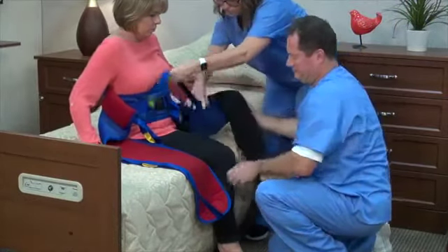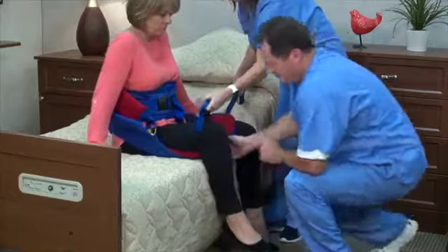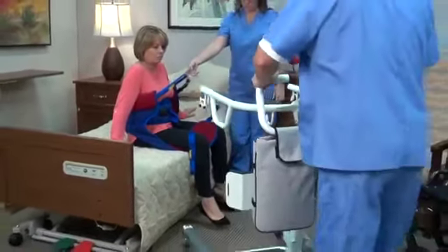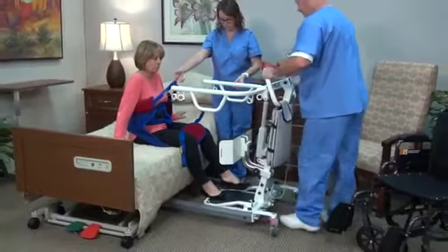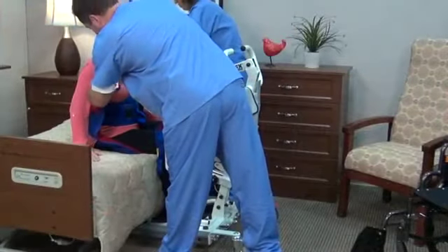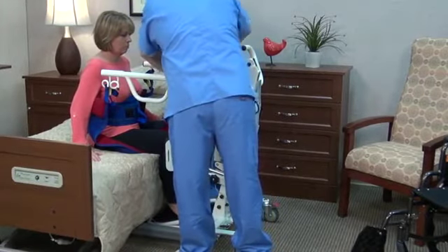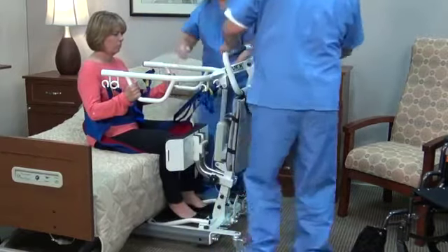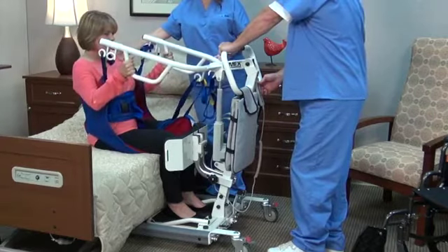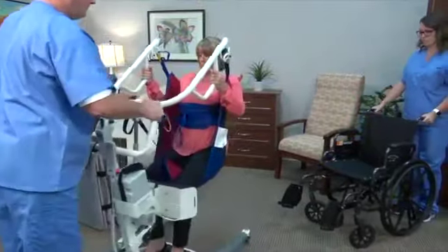Position the leg loops under and between the resident's legs. Cross the leg loops through each other. Move the lift slowly towards the resident. Place feet on the foot platform. Attach leg straps to the front hooks, followed by upper straps to the side hooks. Ensure that the leg sections are positioned midway under the thighs to provide good support and greater comfort.